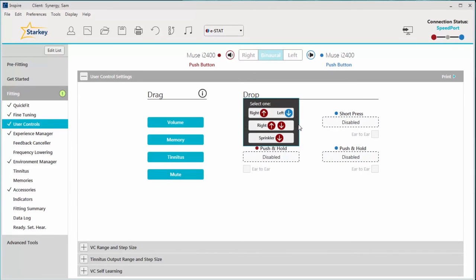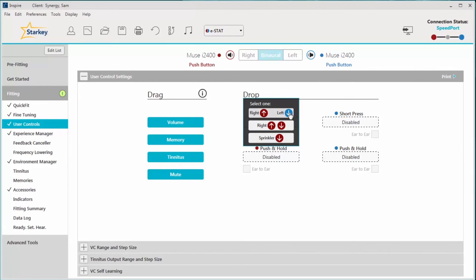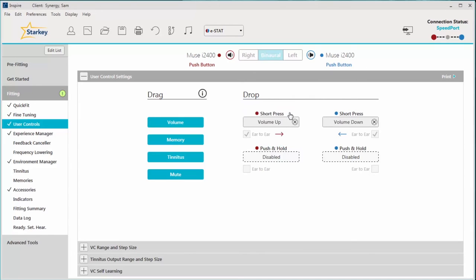Once you let go of the mouse, select how you'd like the volume control to function. For this case, we will choose right raise, left lower. So with a simple short press on the right aid, both hearing aid volumes will increase, and with a short press on the left aid, both hearing aid volumes will decrease.